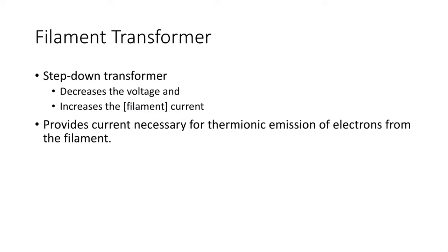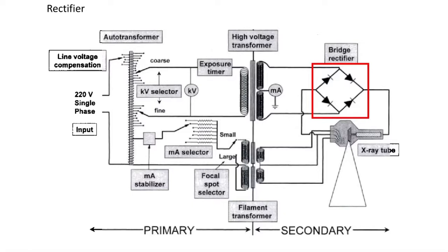Okay. And then the next important component is what is known as a rectifier. Before we talk about a rectifier, I would like to bring something to your attention, or maybe let me pose it in a way of a question. Did you realize that inside of an X-ray tube insert, electrons always flow from the filament to the target? Electrons don't flow backward. They always flow this way. They never flow backward.